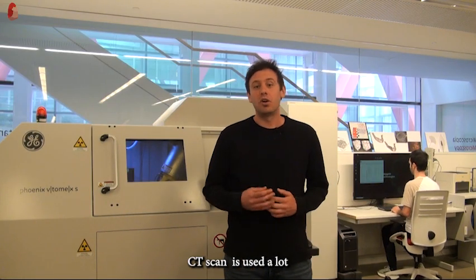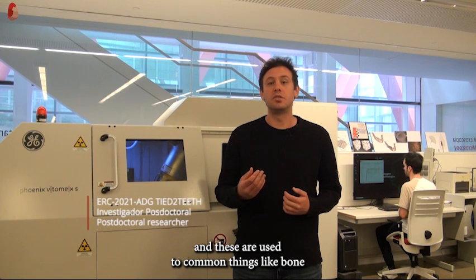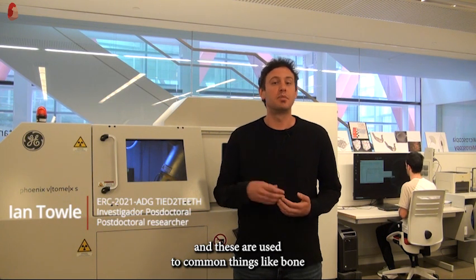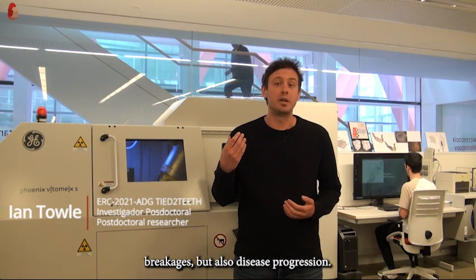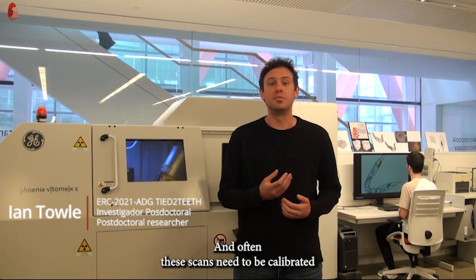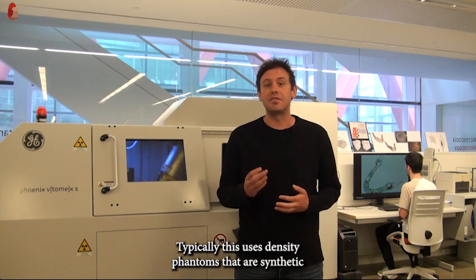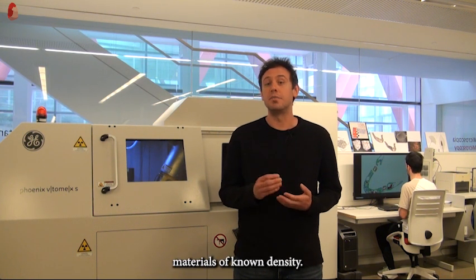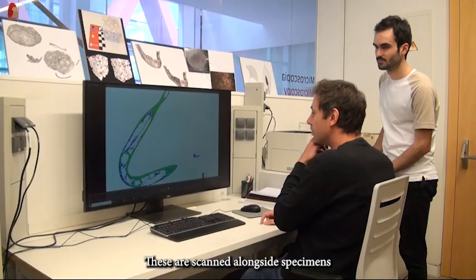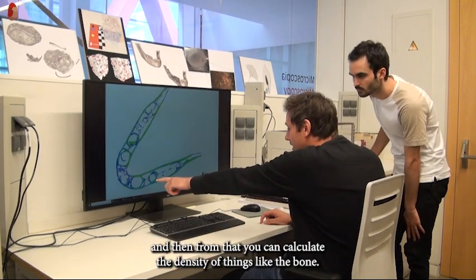CT scanning is used a lot in medical situations, and these are used for common things like bone breakages, but also disease progression. And often these scans need to be calibrated so that density of different body tissues can be calculated. Typically, this uses density phantoms that are synthetic materials of known density. These are scanned alongside specimens, and then from that you can calculate the density of things like the bone.